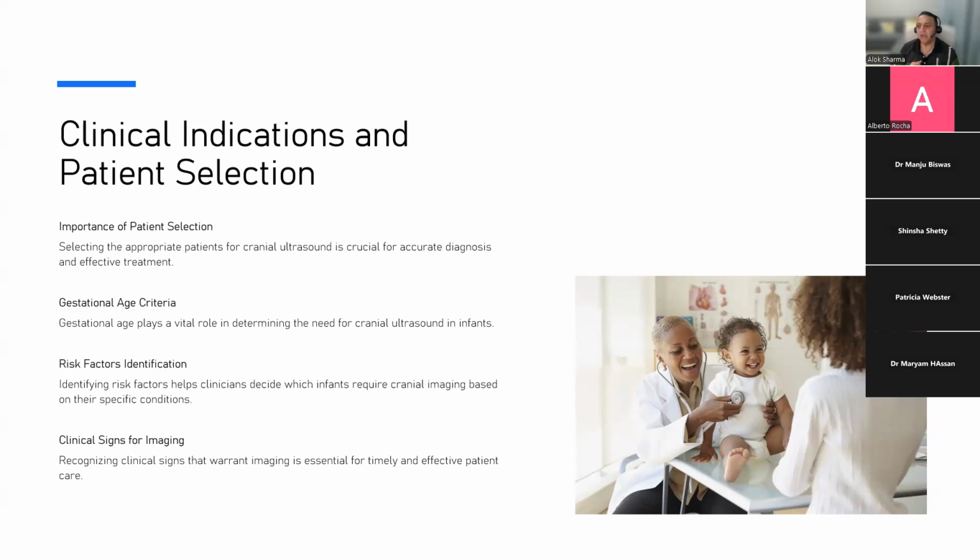But more importantly, there are certain neuroimaging procedures that might give us better and more appropriate information that we are looking for. For units who now have MRI on the neonatal unit, where they can take babies for that, we very much know that MRI is a very important aspect in the management of babies with HIE, to the point where people are actually starting to do early MRIs, even in cooled babies, to try and look at SWI and DWI and make not just diagnostic, but actually therapeutic decisions.